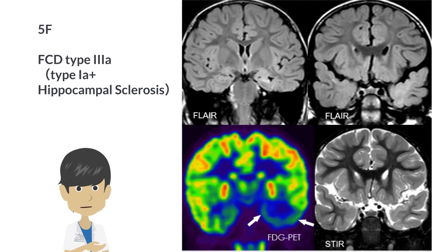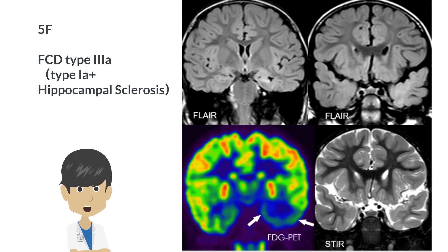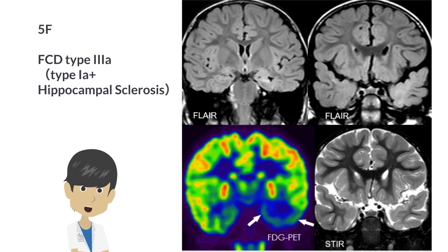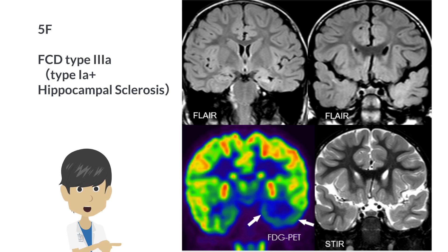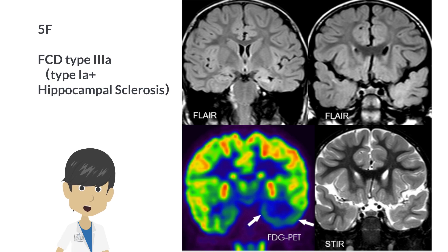A case of focal cortical dysplasia type 3a is shown. In addition to the left hippocampal sclerosis on FLAIR, there is a high signal indicating focal cortical dysplasia in the left temporal pole. FDG PET shows widespread hypometabolism from the left medial temporal lobe to the temporal base and lateral temporal cortex.